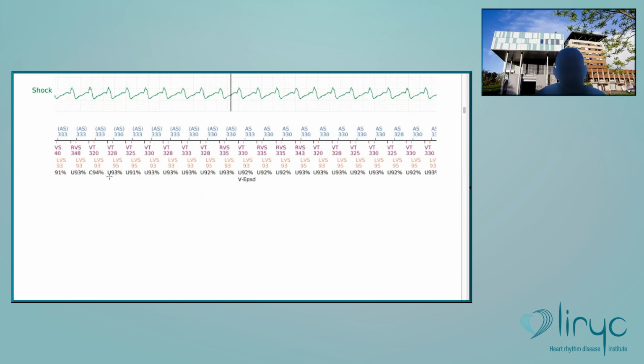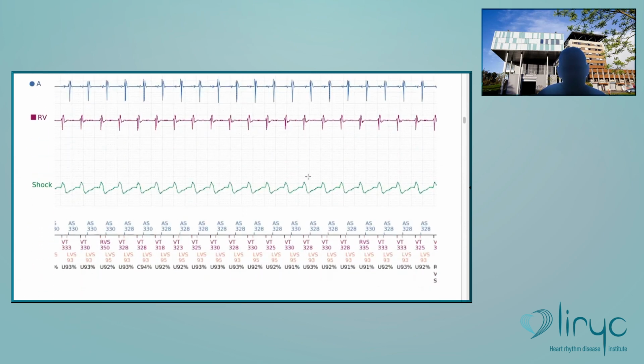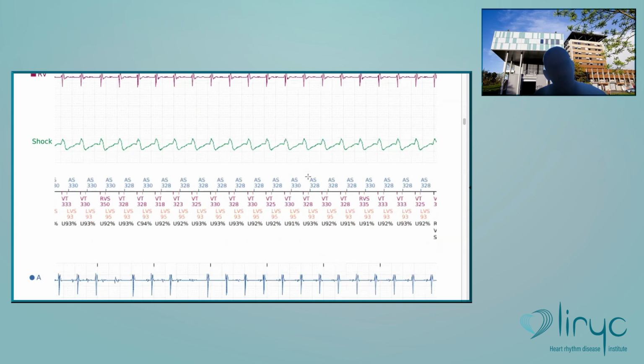You see, 94% if you program 83. I just repeated it systematically, and you see that you will have a correct diagnosis. And in most, not to say all, but I think in all the VT I have seen, it's the same. 83% was also correct, meaning that during VT, sometimes you are 0%, sometimes 10%, sometimes it grows close to 83, but most of the time it's less. So the sensitivity remains close to 100%.